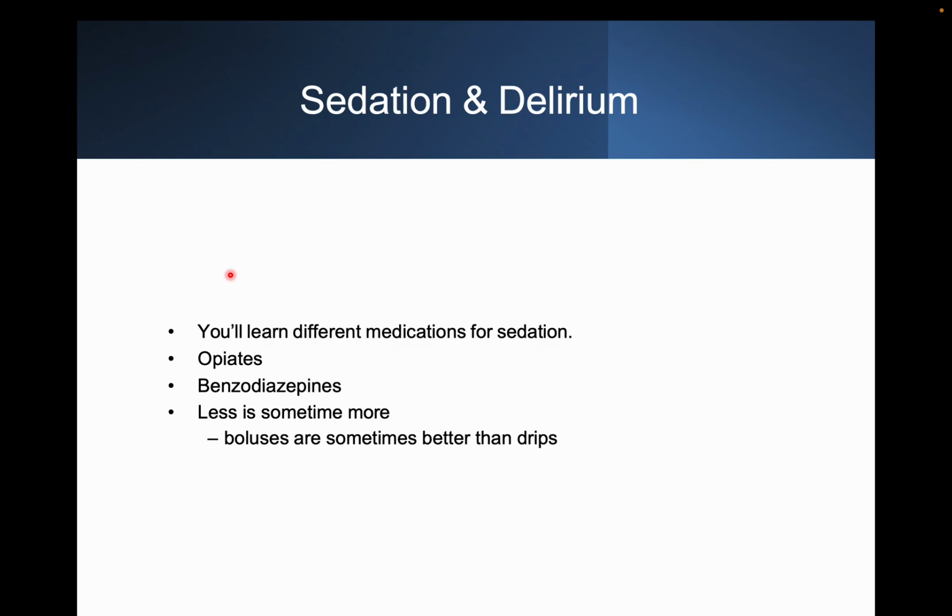Then you check for any blocks, any P peak and P plateau changes, any mucus plugs, any kinking of the tube, any bronchospasm. Then the next thing, you check for any auto PEEP. How do you check auto PEEP? I'll put up a case based scenario.